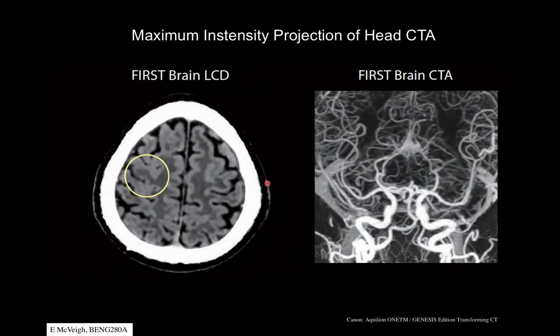So state-of-the-art CT images are pretty outstanding. These are sort of recent images of a human brain with CT. Imaging the brain with X-rays is a little difficult because you have a bony skull around the entire brain, and so getting X-rays through the skull is kind of difficult. And it was a major challenge in X-ray radiography for years and years. But you can see very nice soft tissue contrast now with CT.